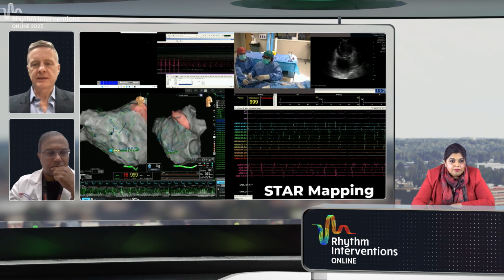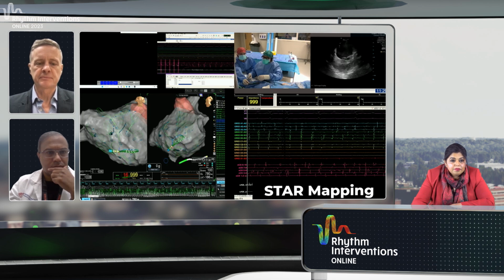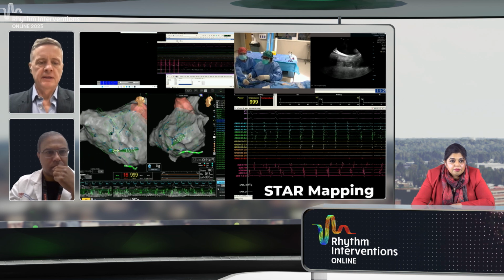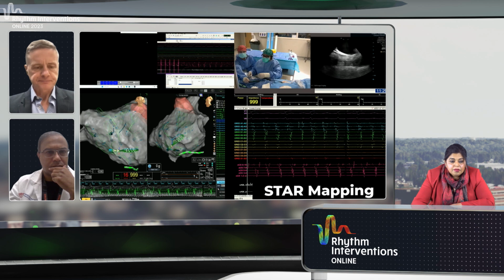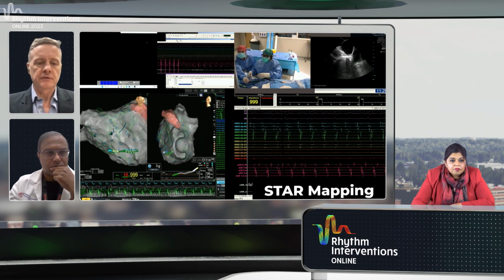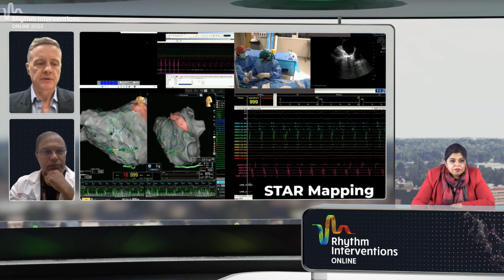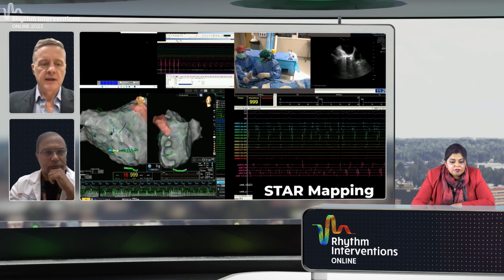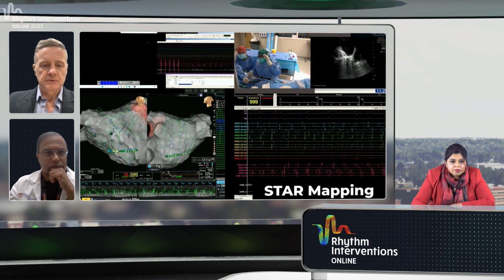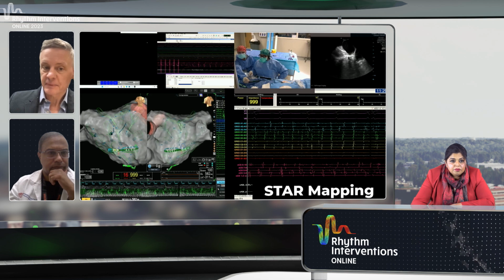Yeah, so I think it's important for the audience to remember that the map is based on the unipolar electrogram timings, there's no filtering or secret processing. And what we're really doing is showing the patterns of activation based on those unipolar electrograms. And if you remember the old studies of Allessie using epicardial arrays on surgical patients, how long it took Michel de Groot to analyze those data just for a few seconds by hand.